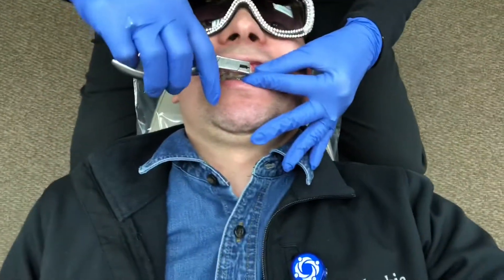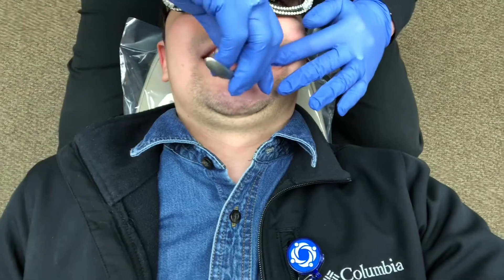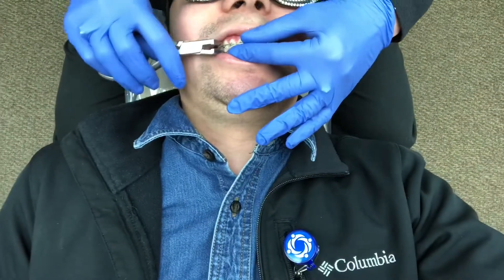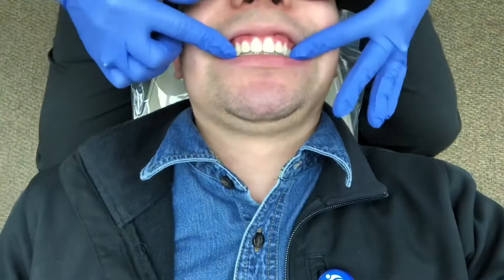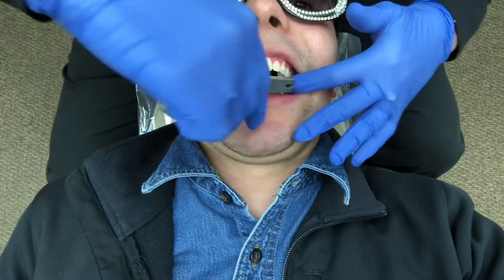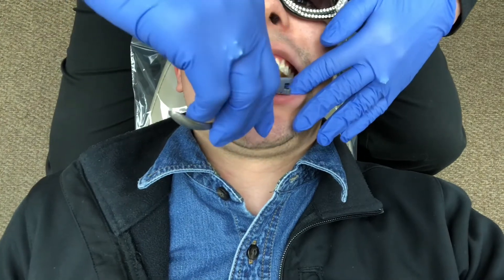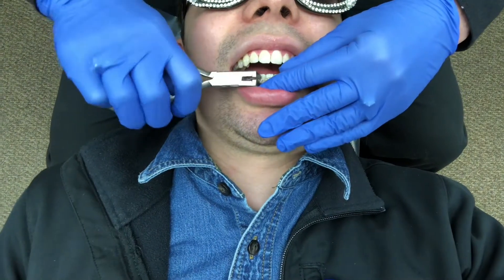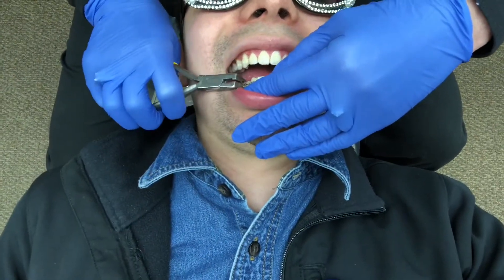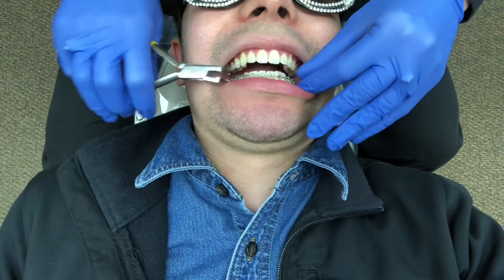Alright Julian, are you happy with everything in your mouth? I'm not — the wire part. Okay, so this goes pretty fast, are you ready? Yeah, here we go. This is what it feels like. Top braces are off — you're gonna see the chunky little glue that we're gonna polish off in just a minute. Open on up, here comes the bottom. Bottom braces are off.